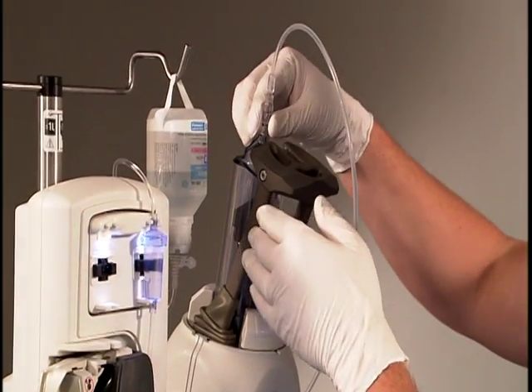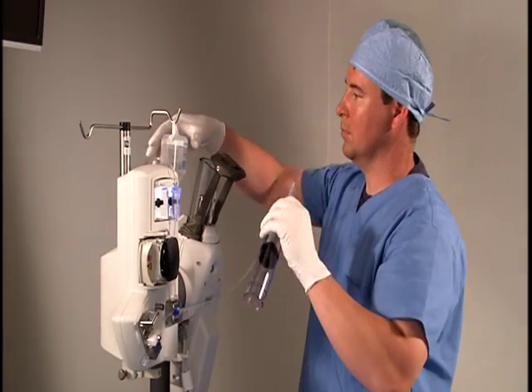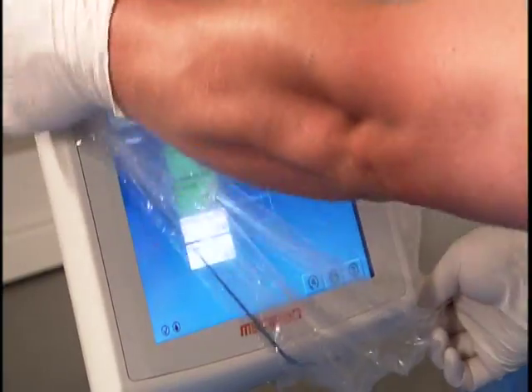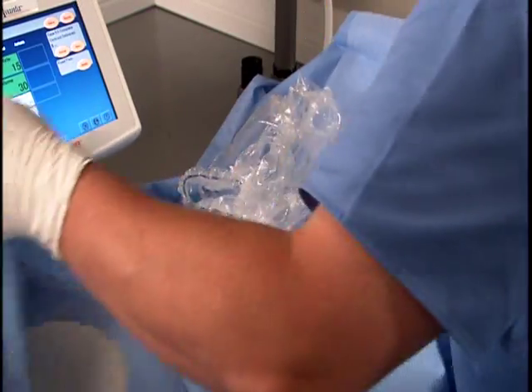Simply turn the syringe 1/4 turn clockwise to remove it from the piston at any position while it is still attached to the MPAT disposable tubing. The disposables have been designed to minimize contrast spillage during removal.